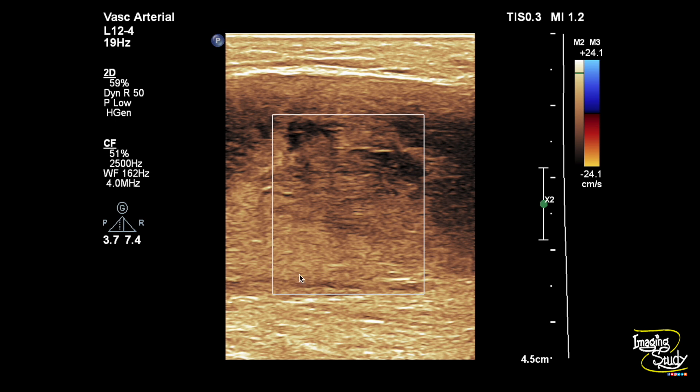We have applied color Doppler. There was no flow, as this is concealed blood. If there is any active bleeding occurring, you may see some flow there.